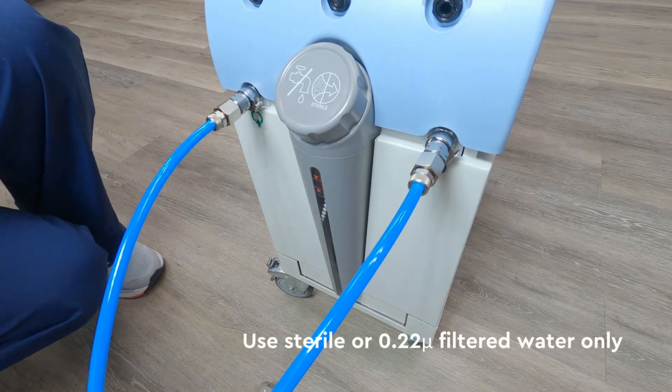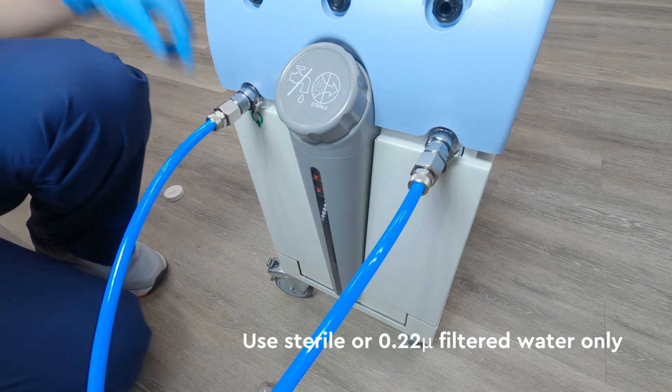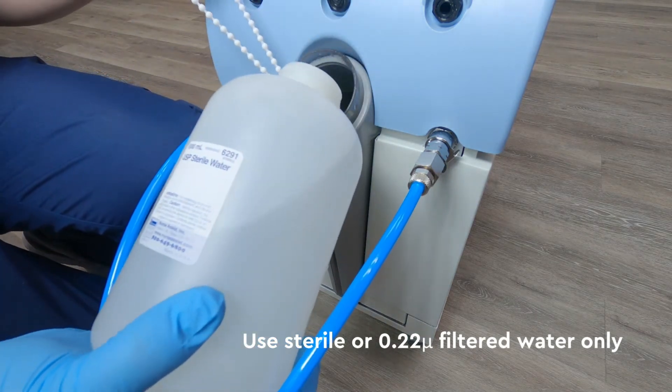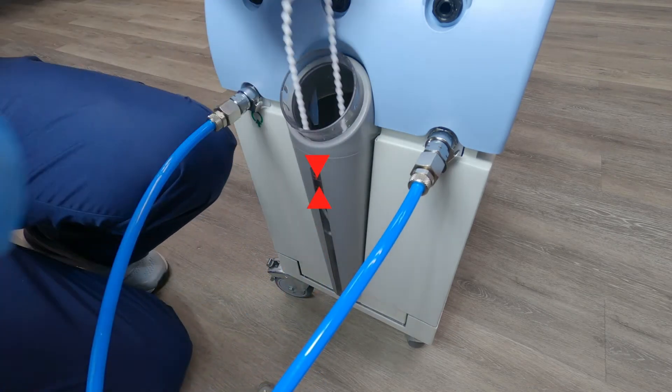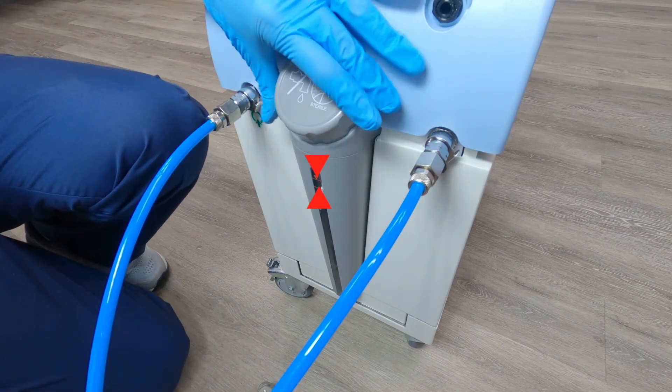Using only sterile or 0.22 micron filtered water, remove the gray cap and fill the water tank. Make sure the water line falls in between the two red lines. A full tank has six liters of water.